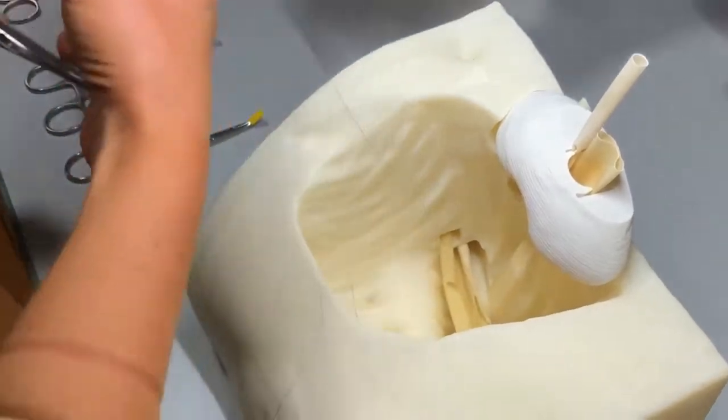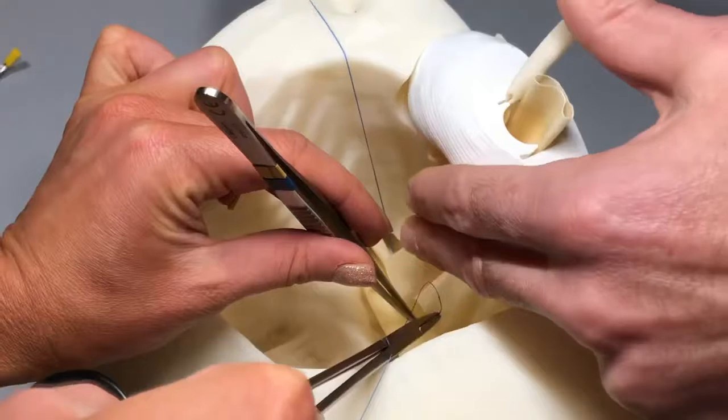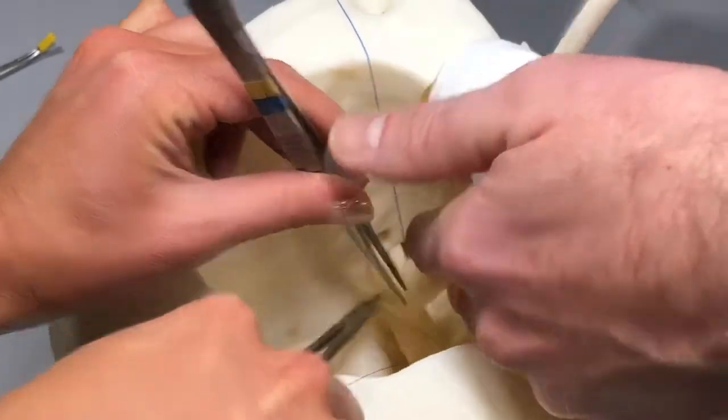The first step in the renal vein anastomosis is anchoring the superior and inferior aspects of the anastomosis with a stay suture. These can be placed forehand or backhand depending on the best angle for the surgeon.